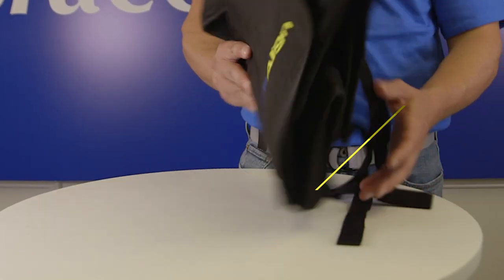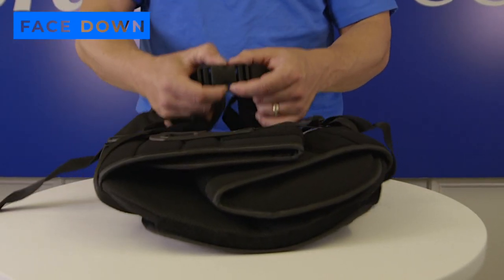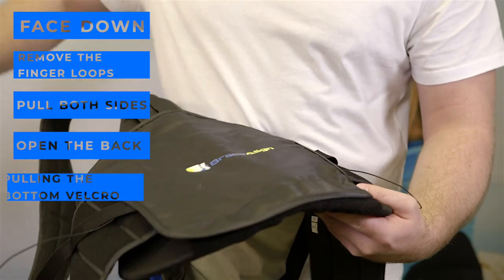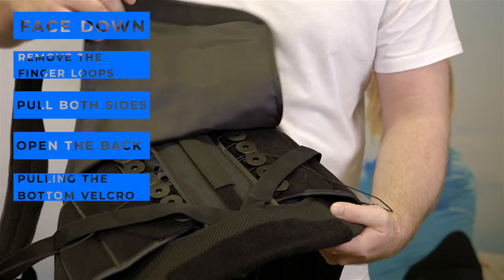To fit this brace, set it face down with the back facing up. Remove the finger loops from the belt and pull both sides. Open the back by pulling the bottom velcro loose, exposing the pulley system.